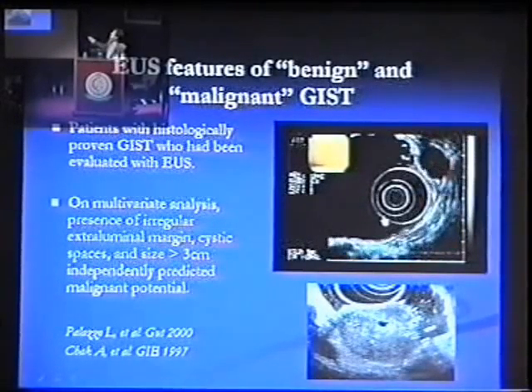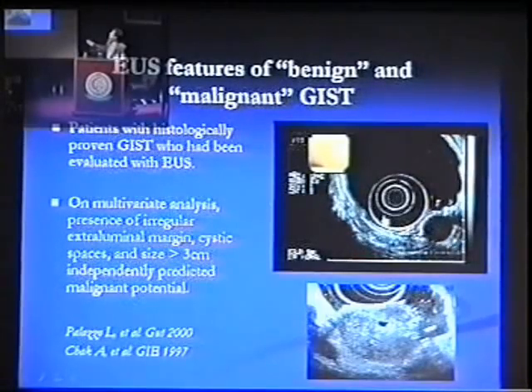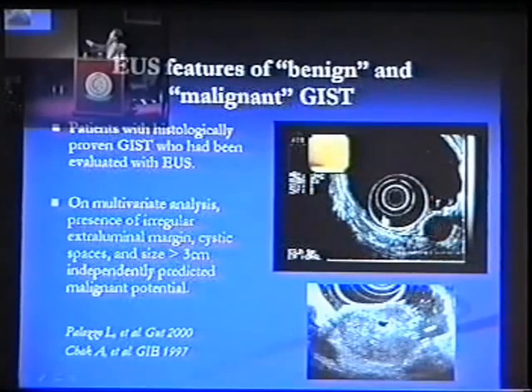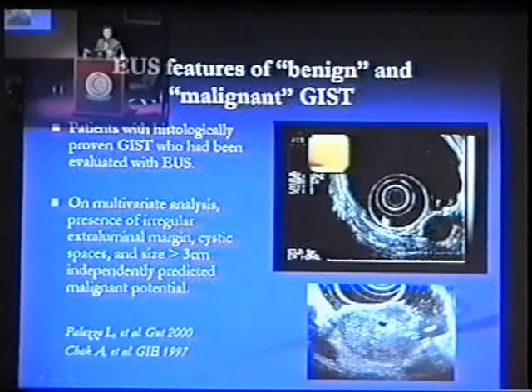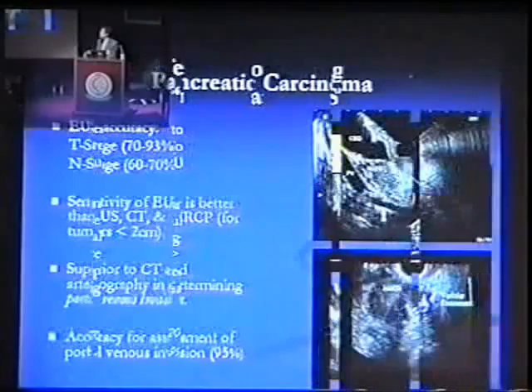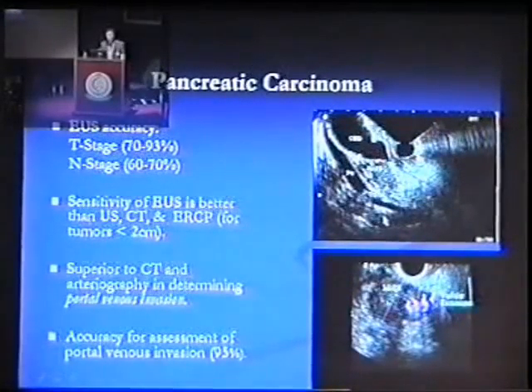You can see here how we have this lesion that is completely continuous with the muscularis layer. So this is a diagnosis of GIST, and some features on EUS to help you determine if this GIST has a high malignant potential or low malignant potential.